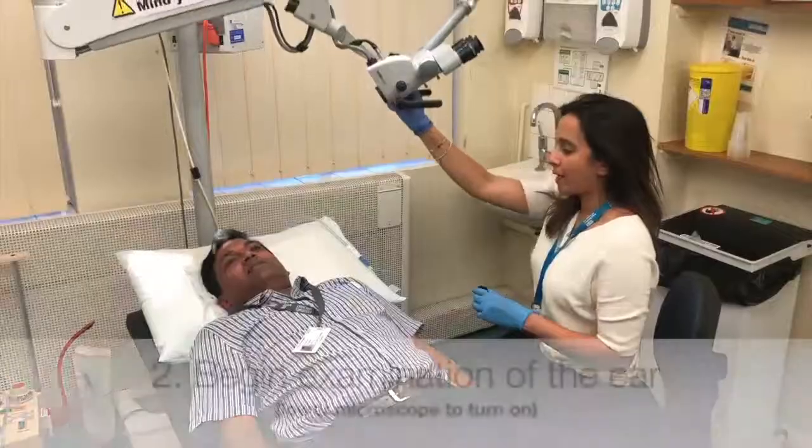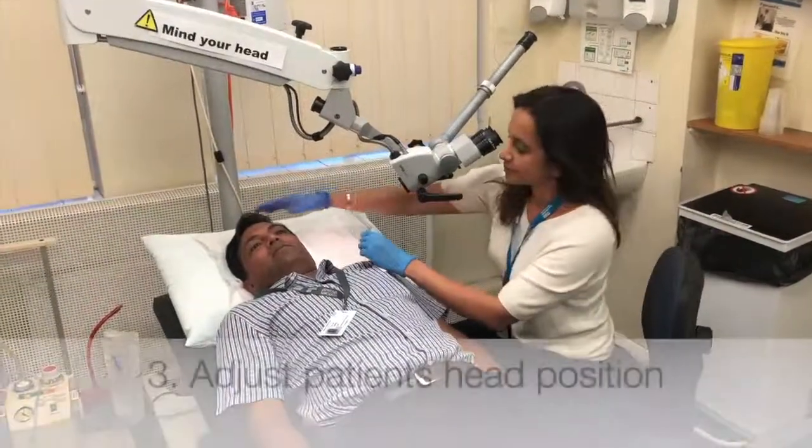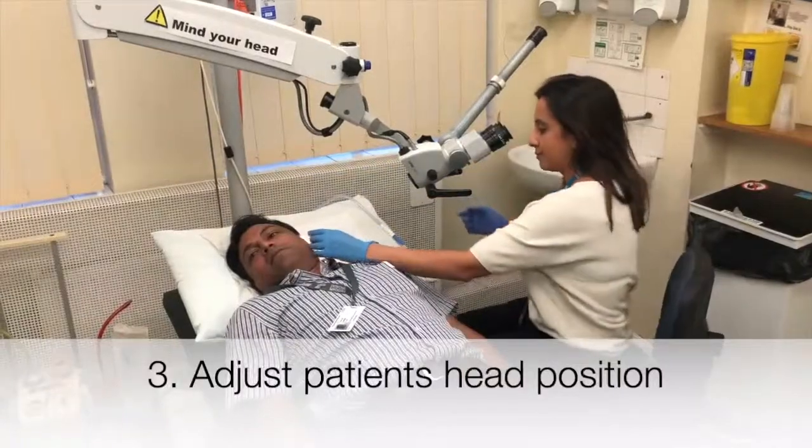Some microscopes have a teaching arm. Begin examination of the ear, adjusting the patient's head position as necessary.